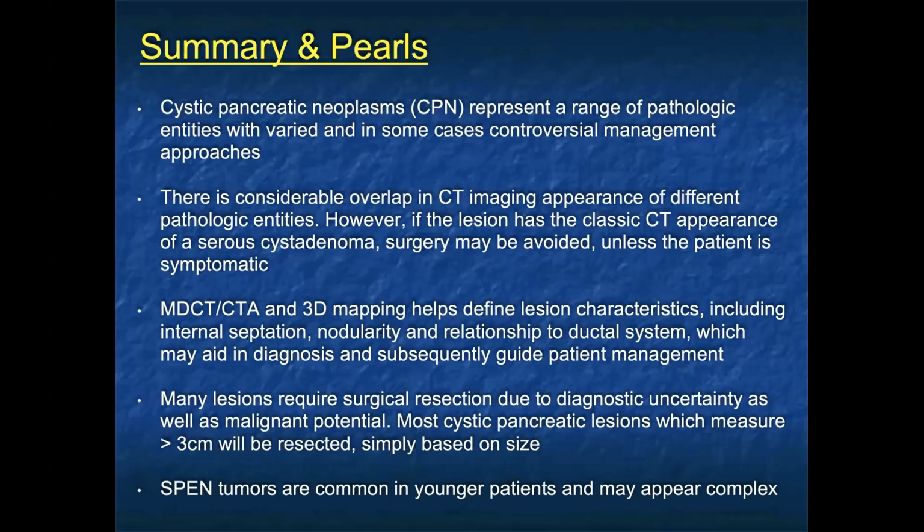I think there's a challenge sometimes. We've had patients with cystic lesions which ended up being abscesses post-op pancreatic cancer, which looked very much, in the right scenario, like recurrent tumor, but the patient's markers were fine. And in some of those cases, the patient wasn't even febrile. So that's important to look at.